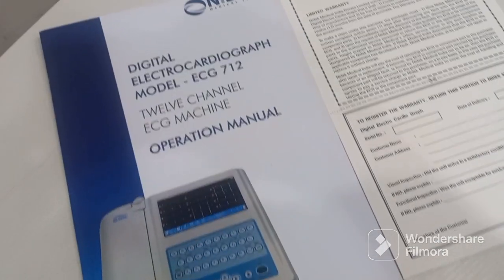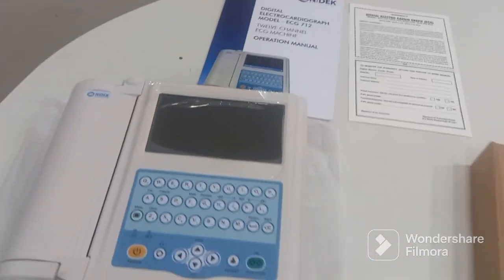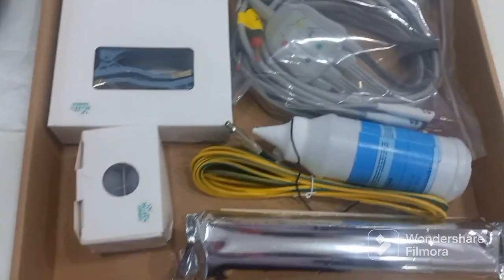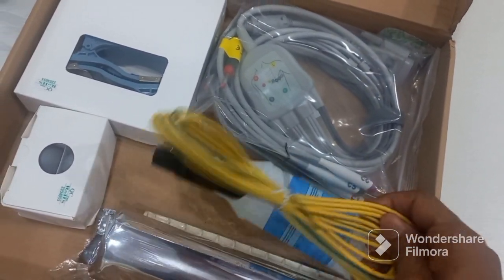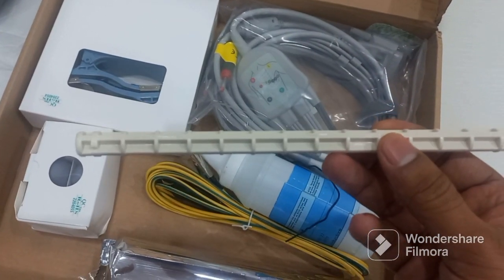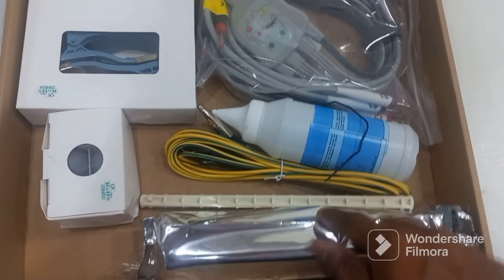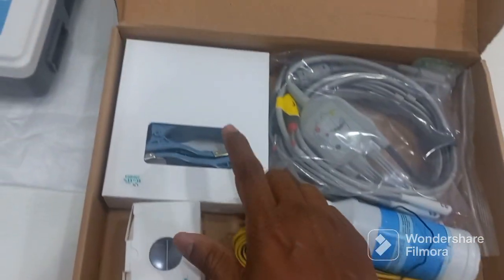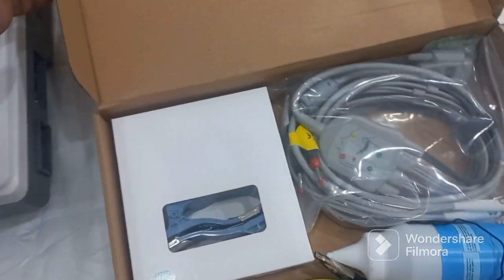At the back we have all the details of the machine like the serial number. Along with the machine you get a user manual, a warranty card, and an accessories box. Inside the box you get the ECG cable, gel, an earthing cable, a power cord, and a roller which is used to put the paper roll. You also get the limb electrodes and the chest electrodes — so all the accessories come along with the machine.